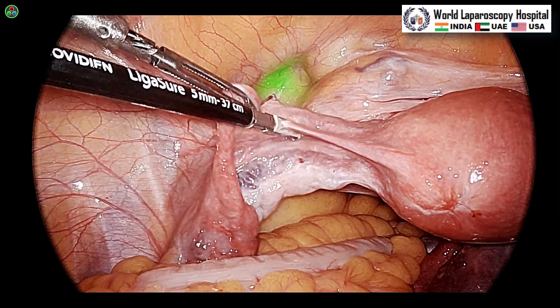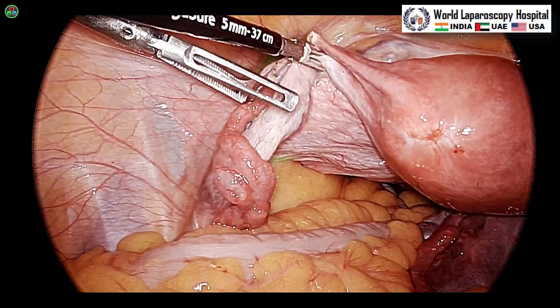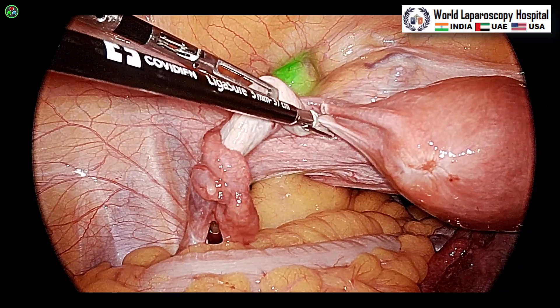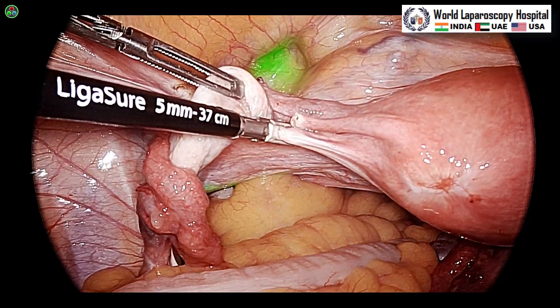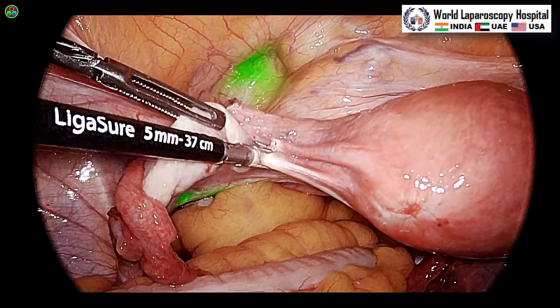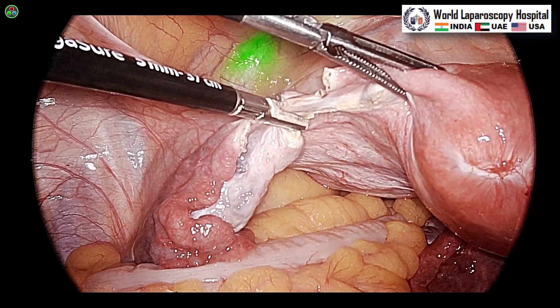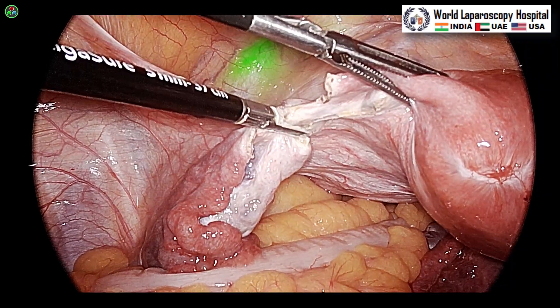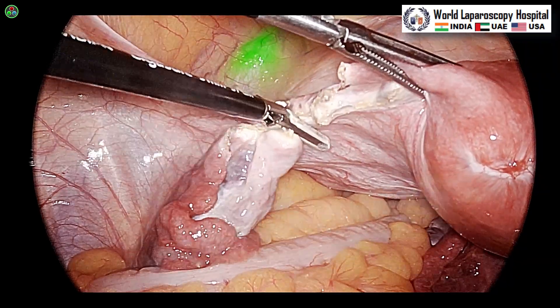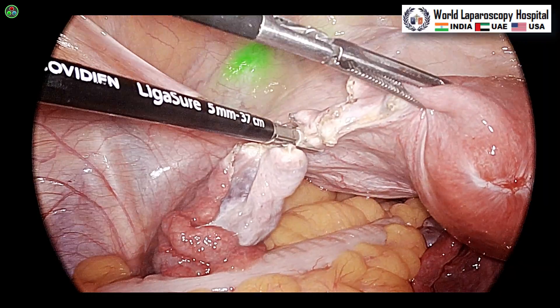Right now we are in the ENV mode of the camera. The 1788 has not yet launched in India — it will launch in September, but because I am on the advisory board of Stryker, they have given me the opportunity to test this camera and know its capabilities. This is the left side where the round ligament, fallopian tube, and ovarian ligament are taken, and then 2.5 cm over the broad ligament.